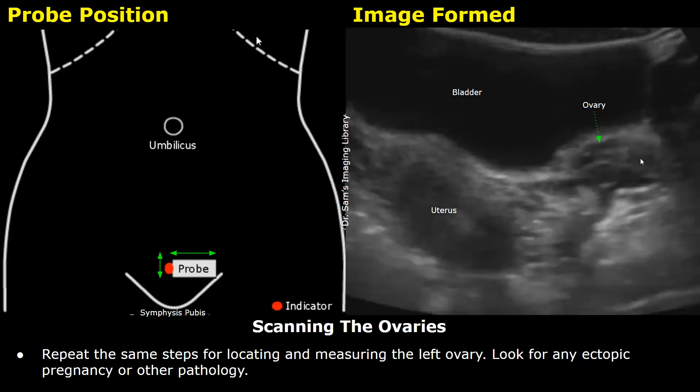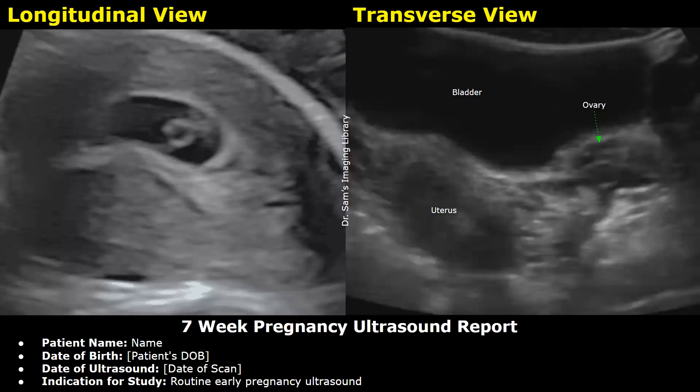Repeat the same steps for the left ovary as well, examining the entire left ovary for any ectopic pregnancy or other pathology. The ultrasound scan is now complete, and now you can write the report.